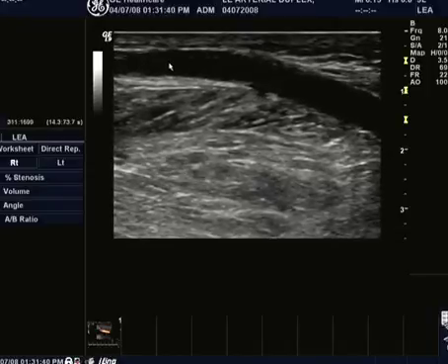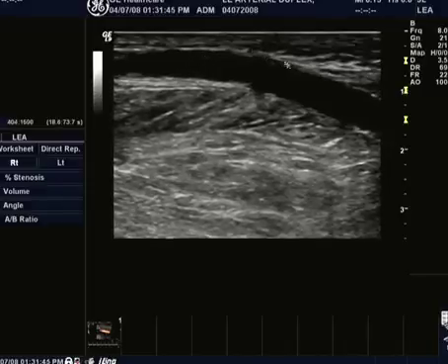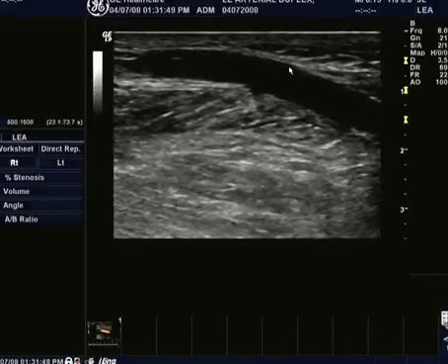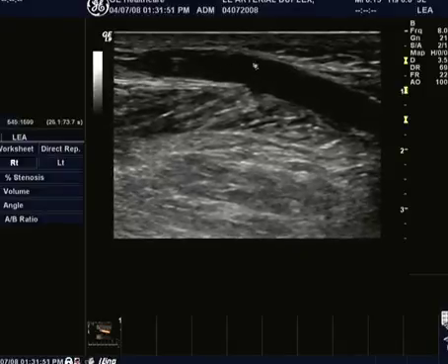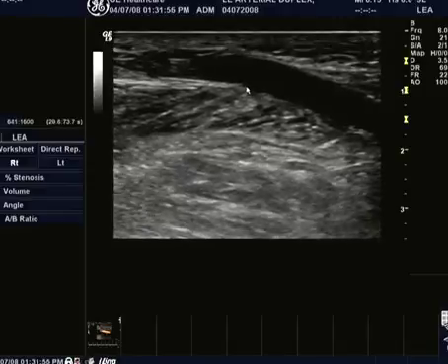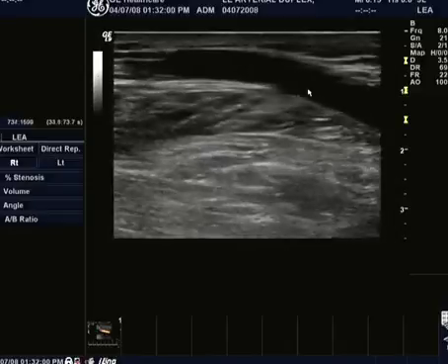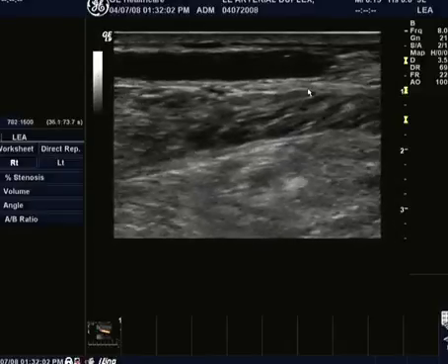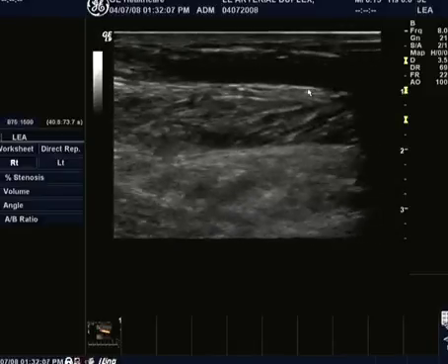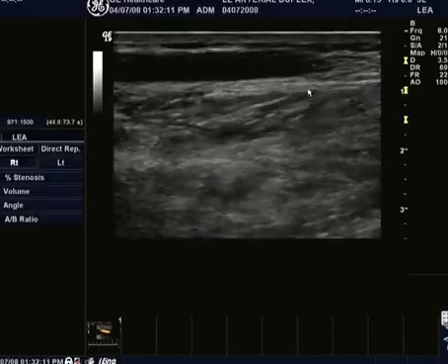Now, what's going to happen at this curve? Things are going to change again, right? We know when we go around a curve in our car, we can feel the force when we swing around that curve. That same force is acting on the blood cells in this blood vessel around this curve. So we're not going to want to listen right at this bend or even right here. So I'm going to come back up here just a little bit, and let's take another signal of our velocity, just making sure we can record something here.